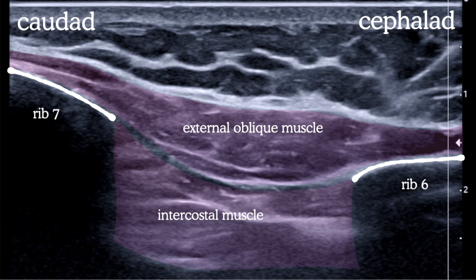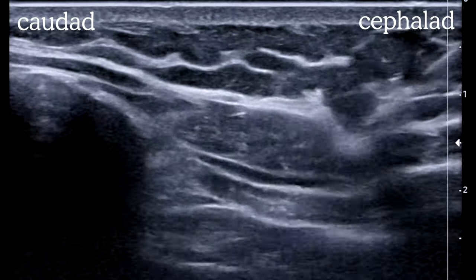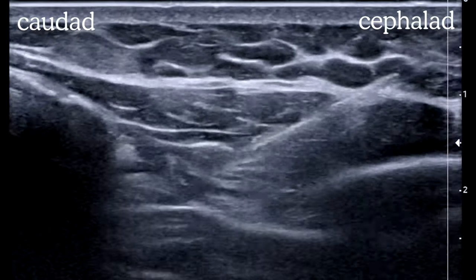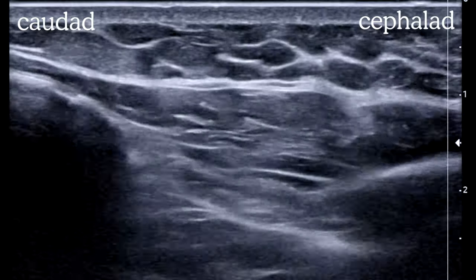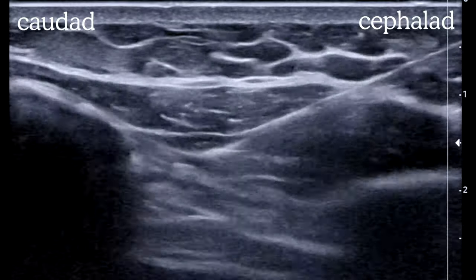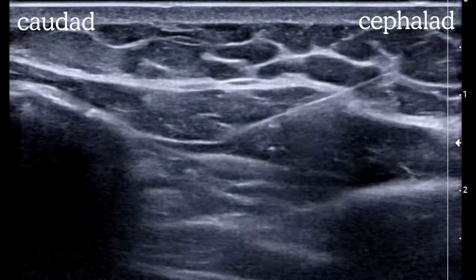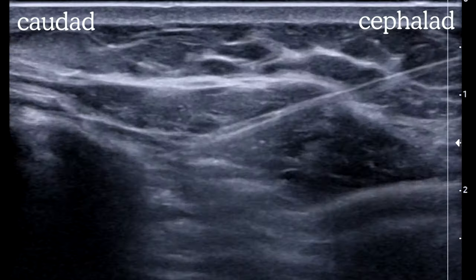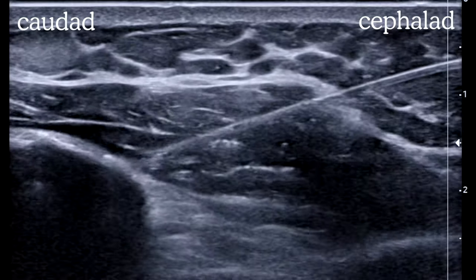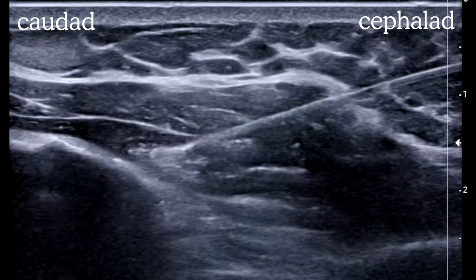Here's that anatomy again pre-block. Now the needle is advancing from the cephalad aspect, entering the external oblique muscle. Our initial injection creates a space, but isn't spreading up and over the rib like we want. We push forward towards the rib and then inject again, this time with good elevation of the muscle. We'll use a total of 20 to 30 mls of dilute local anesthetic per side.